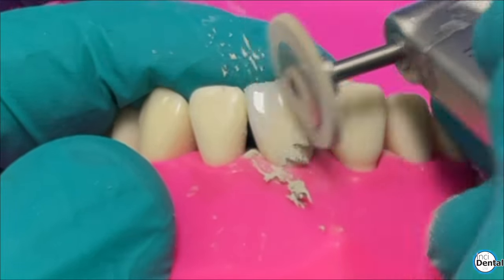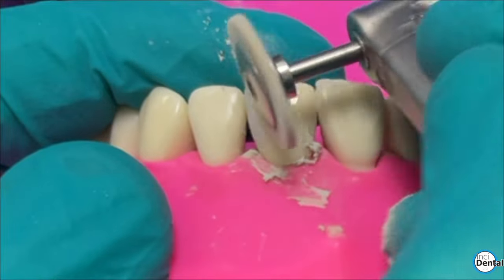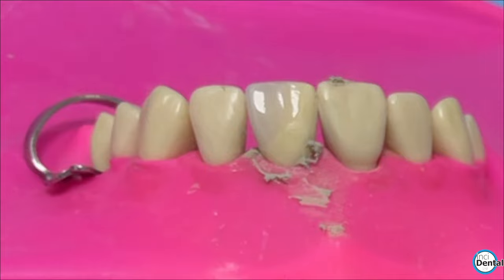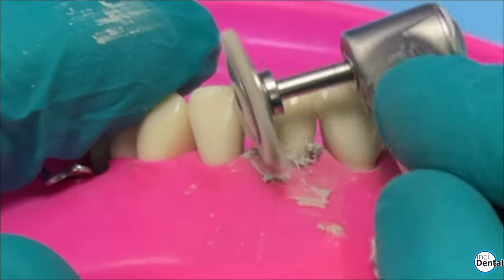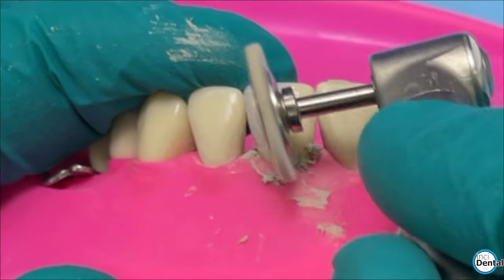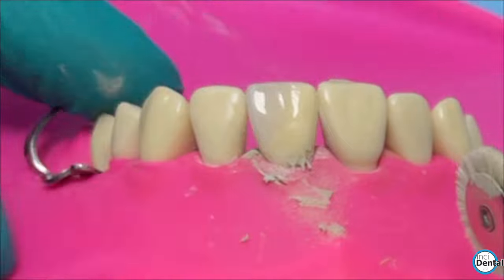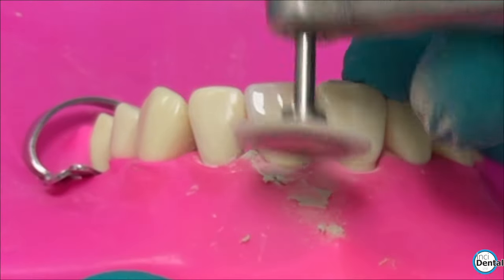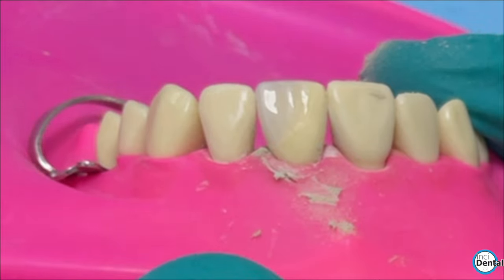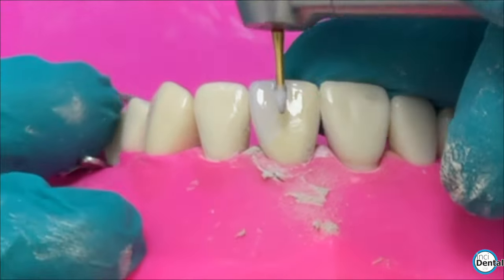If you want to take your polish to the next level — for example if you're doing a few teeth or it's part of a rehab — put some EVE polishing paste onto the goat's head brush and work it in really quite firmly. This is how you get that polish from maybe 95% to even more. You get an incredible polish off these brushes — they're from Mycerium and we retail them — but unfortunately they are single use. You can see the shine you get on that.